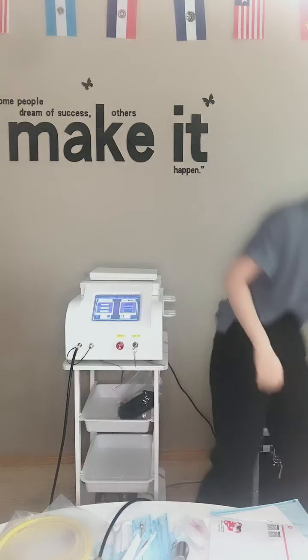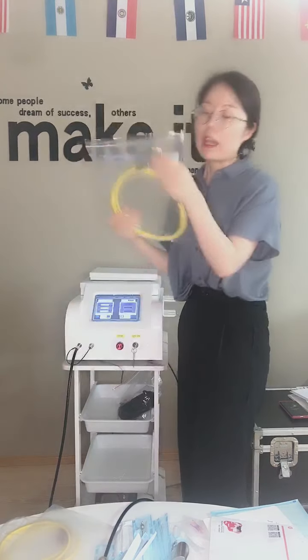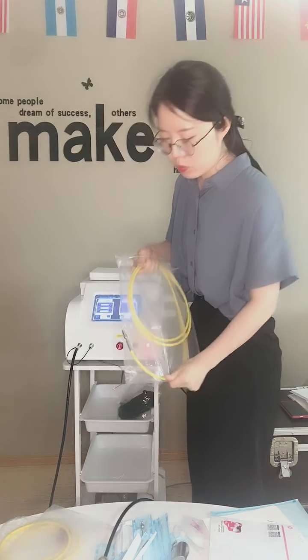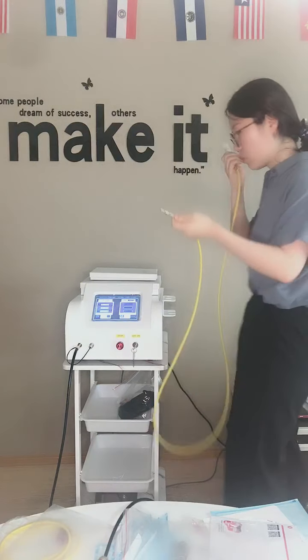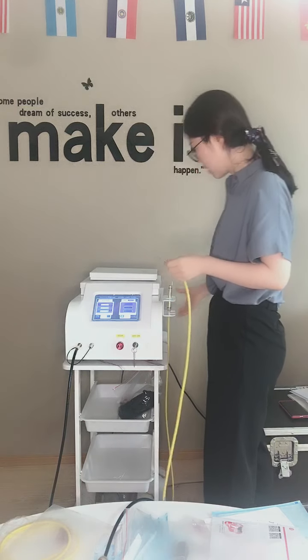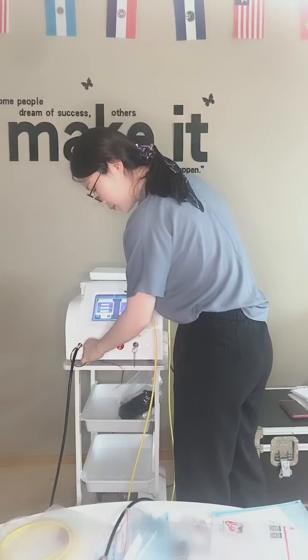Okay, and next, I will introduce you another handpiece, the nail fungus handpiece. Also, it's the same thing when you replace the connector. You need to be very careful with the connector and make sure the connector doesn't get cut. Also, for this one, here is the protection, you can take it out and put it on the handle holder. Here is very hard. And we will replace here.